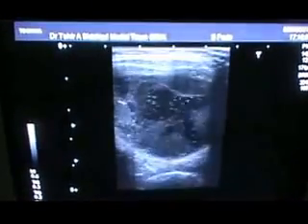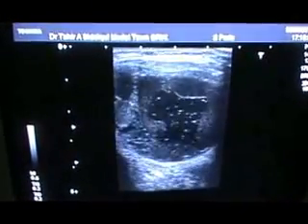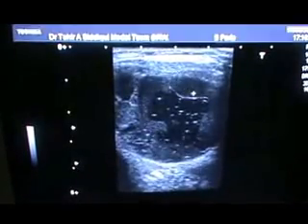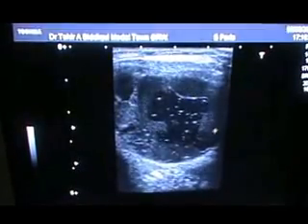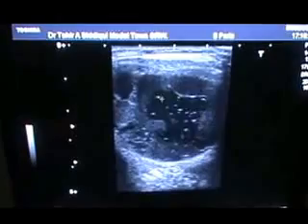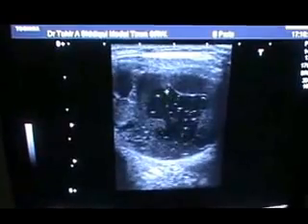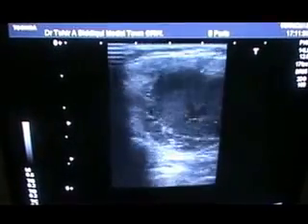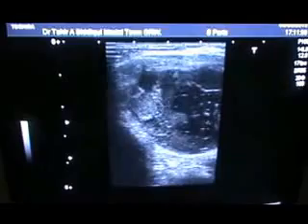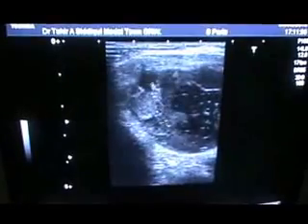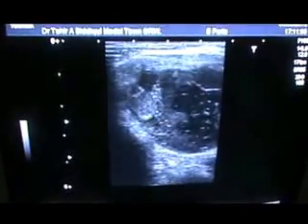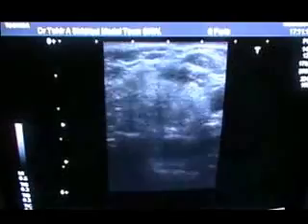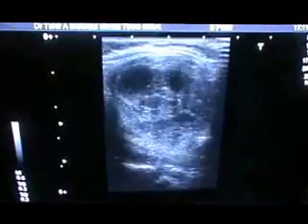Let me show you. If you see, this is a thick echogenic ring around the cystic area in the center, with a few pockets — other pockets as well. This is another pocket, and there are multiple tiny calcifications seen within this mass.